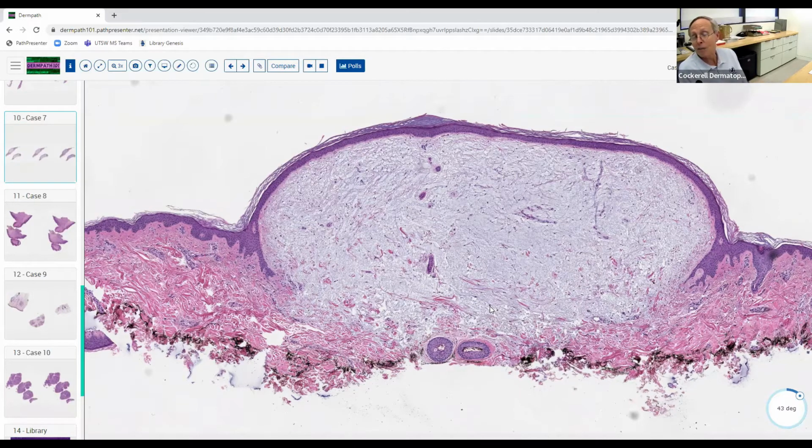You can get deposition of mucin in a lot of diseases. We saw the case of GA earlier, scleromyxedema, papular mucinosis. There are some connective tissue diseases, lupus, dermatomyositis, where you can get abundant mucin deposits in the skin, and pretibial myxedema. So there are a lot of things you can put in your differential diagnosis of reasons mucin ends up in the skin. If it's just a small solitary papule like this, obviously none of those are really germane.